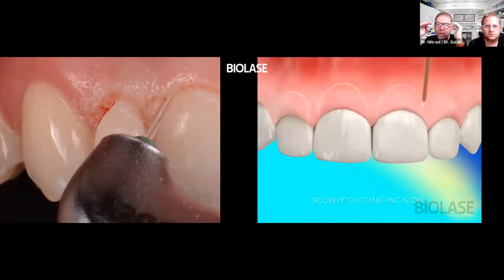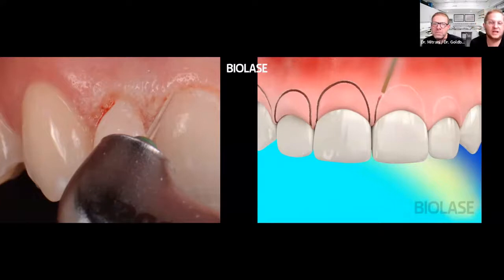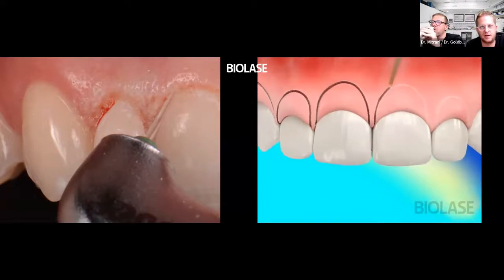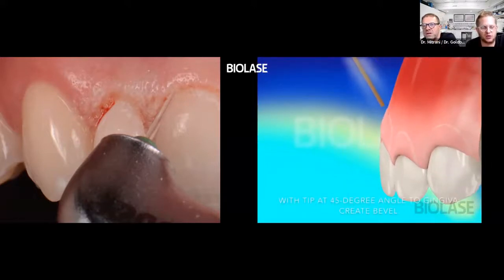The canines were where we wanted them to be, basically had the gingival margins where we wanted them. So this correction is only going to be limited to those 4 teeth, both centrals and the lateral incisors. Now, one of the beauties of these lasers, as Sam was saying at the beginning, is that it's an all tissue laser, so hard and soft tissue. For example, the diode or the Epic is mostly for soft tissue and pain management and other areas. But this laser, you can use for both soft tissue and hard tissue.